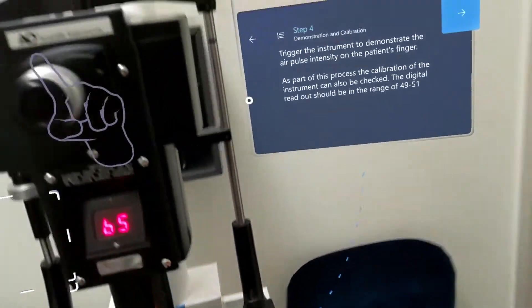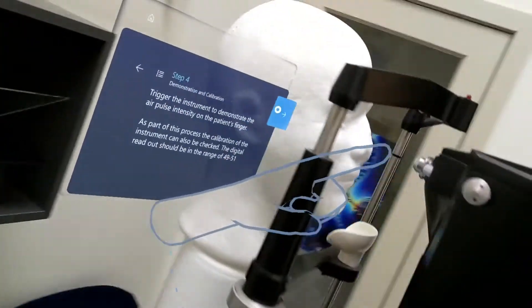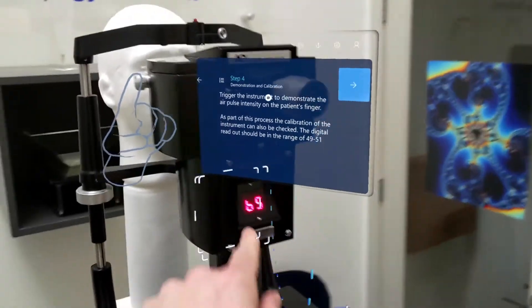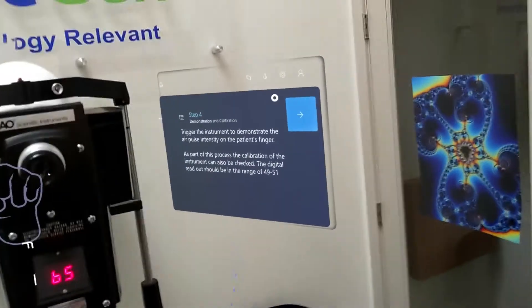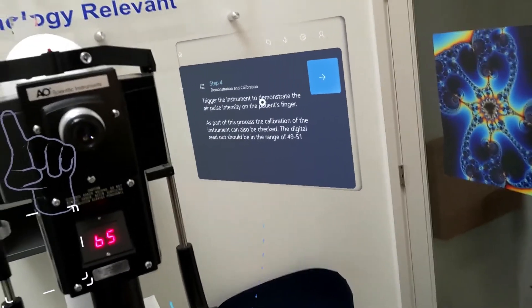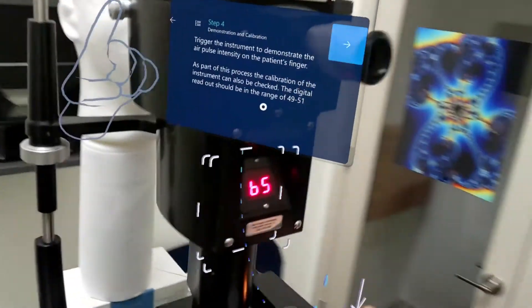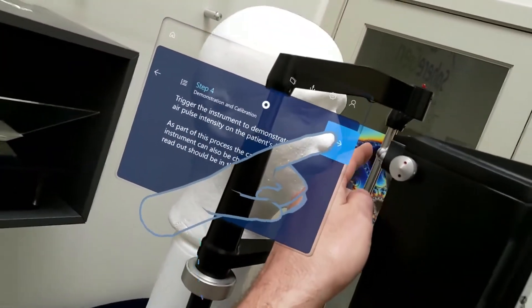Now we know that this button will produce the puff of air. We can go over here — this is where the puff of air is going to come out. We want to be cognizant of this screen, which if this was an actual live operation should read between 49 and 51. For demonstration purposes we're finding 65. Now I can press that button. Excellent.